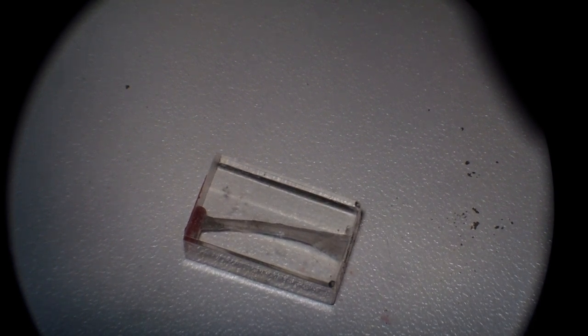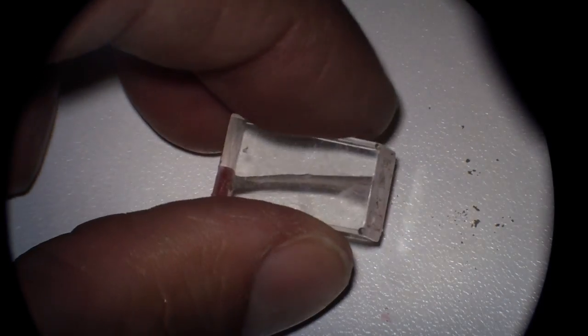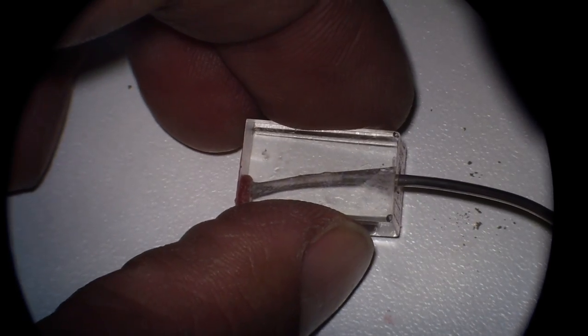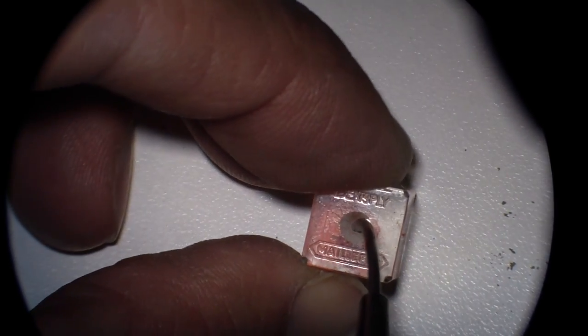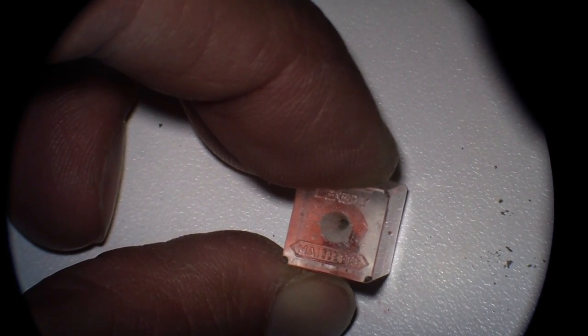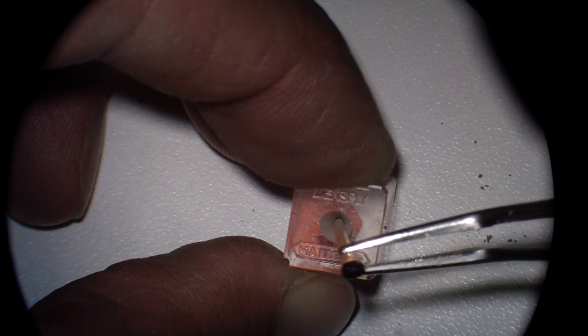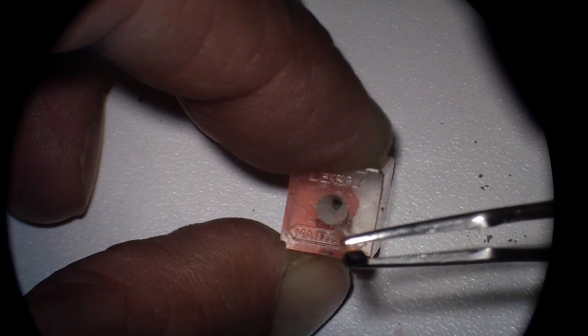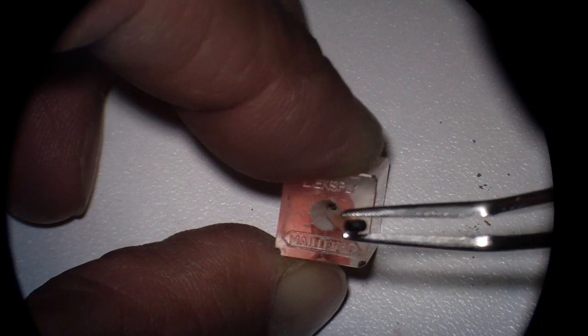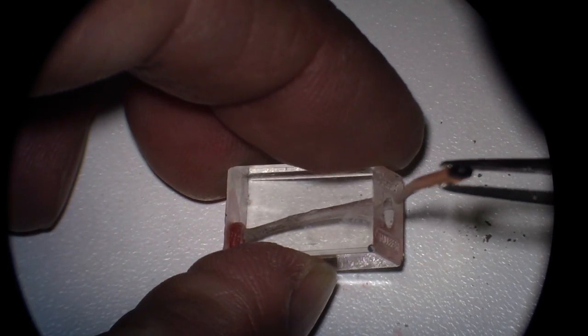So like I was saying, the biology, this was really brought forth to me by one of our speakers, Dr. Ken Hargreaves. And so again, there's the coronal view of what you would see intraorally. And let's just take this down with gutta percha point. Let me get my fingers out of the way. I'm going to carry this apically with gutta percha point. And this is what typically you would see. See it's slowly moving down apically. And there I have it placed. And let's see how far we've gotten.